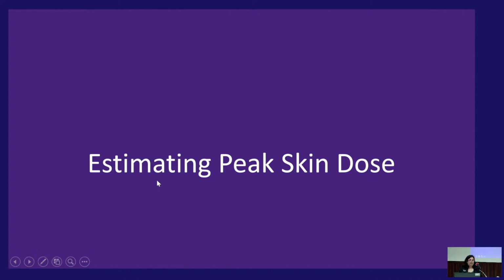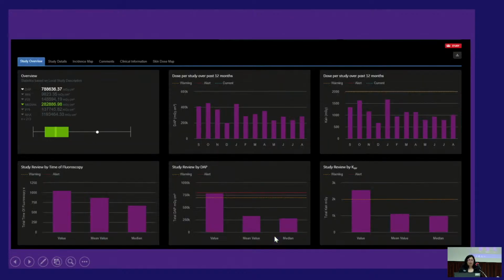This is for interventional radiology, and interventional radiology is pretty high-risk procedures, and there you're worrying not so much about the stochastic risk, you're worrying more about tissue reaction. So I don't really care about cancer risk, but I do care about causing skin injury. So we do want to monitor the peak skin dose to our patients. We have been doing that for years, pre-Dosewatch as well.